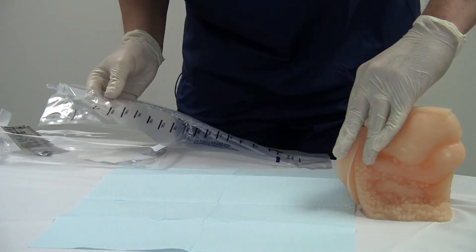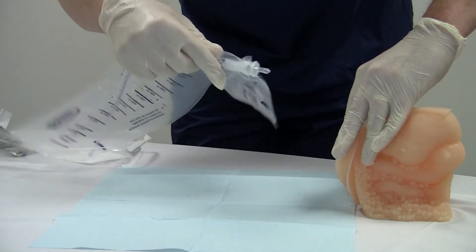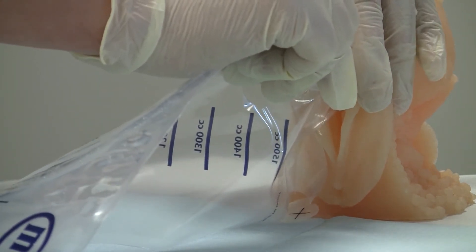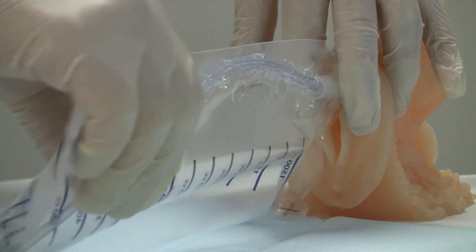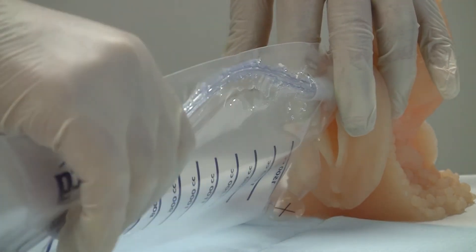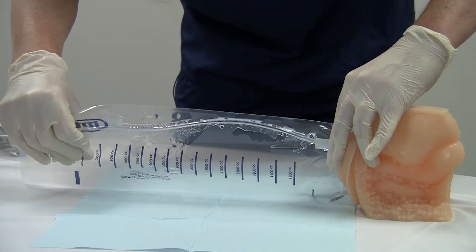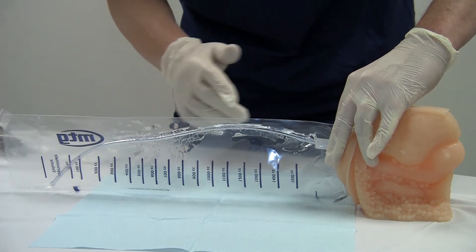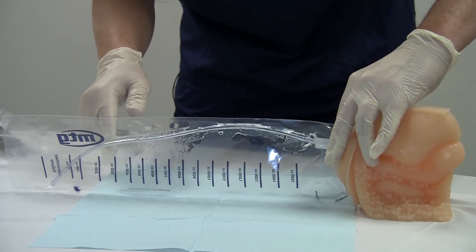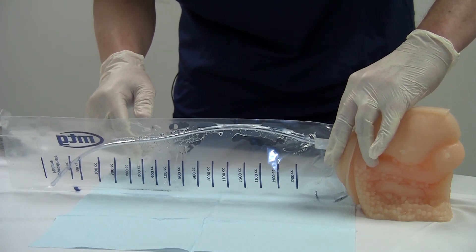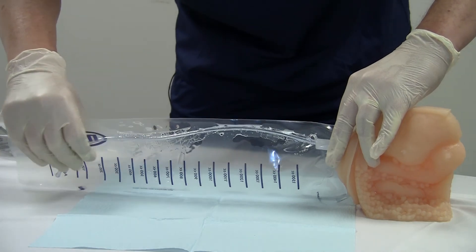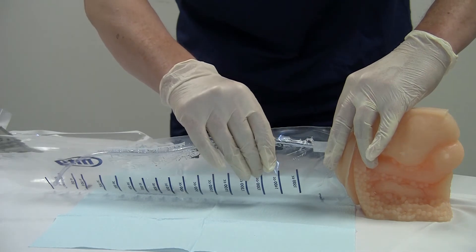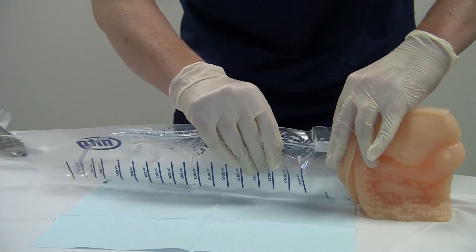Take the catheter at the 1400cc mark and insert the catheter and the introducer tip in the urethra, just as I'm doing here. Use those two fingers to keep everything stable. Notice here that I'm straightening the bag. I want to make sure that the bag is parallel with the legs with the MTG logo up. Once she starts to void, I want the urine to go down into the bag and I want to be able to see the urine flow. Another helpful hint is to pull the catheter as far up in the bag as you possibly can. Now I'm ready to advance the catheter at one to two inches at a time.